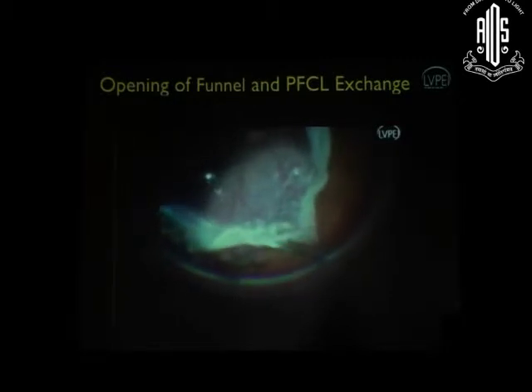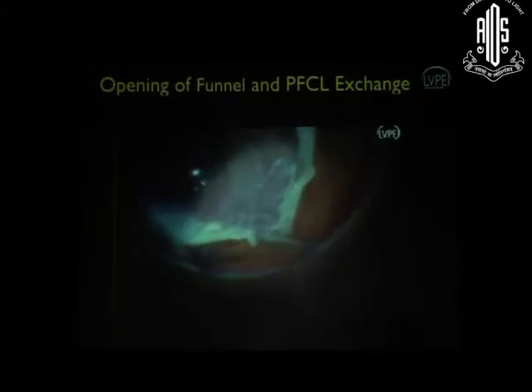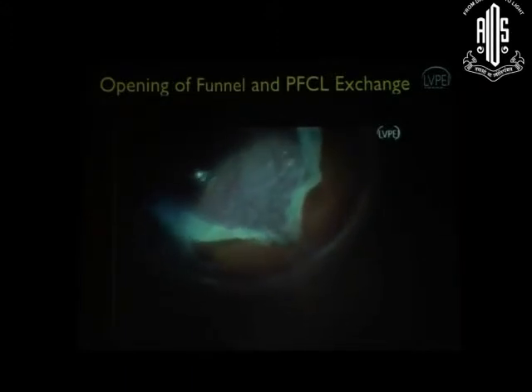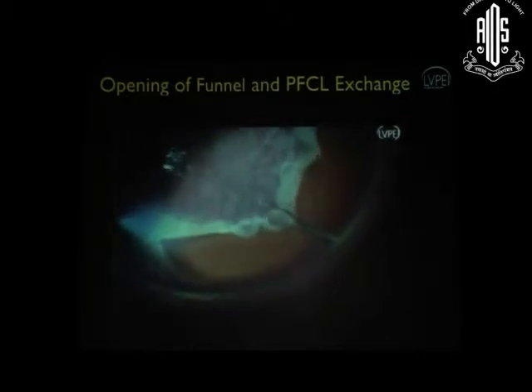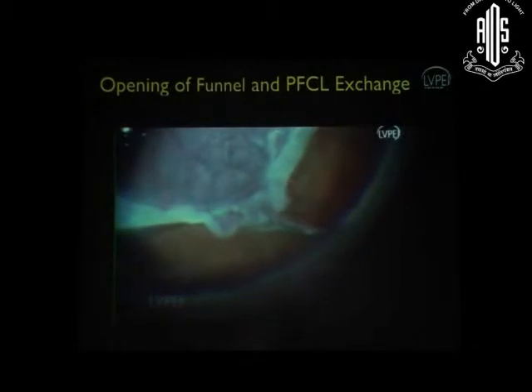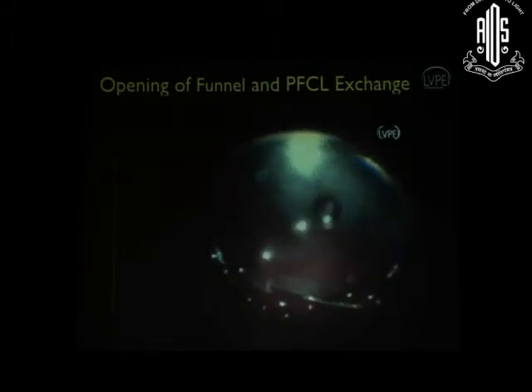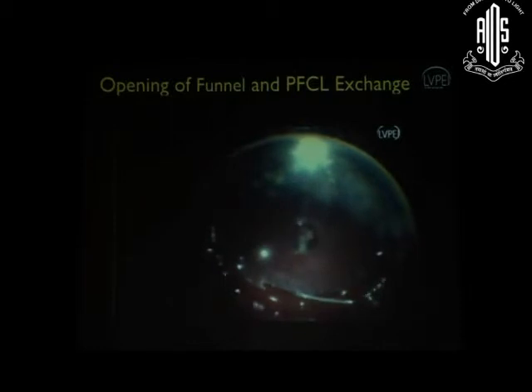So this is where we're unfolding the rolled edges of the retinal flap and trying to remove the small membranes in that peripheral area to open up the whole flap. And if you look at it, the PFCL bubble has still not crossed the edge of the retinal flap. So we're still trying to keep it there, and then I usually do a fluid air exchange. I do it in 25 gauge, so it's not that easy to do a PFCL oil exchange, but I usually prefer to remove the air and then inject oil separately.